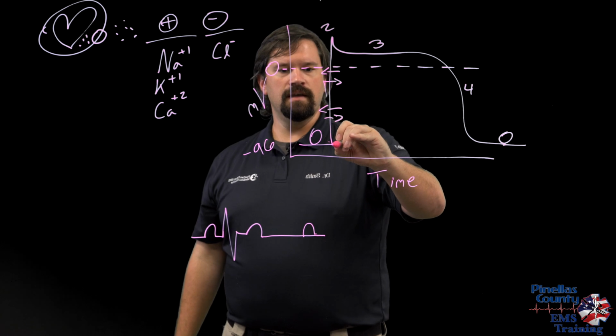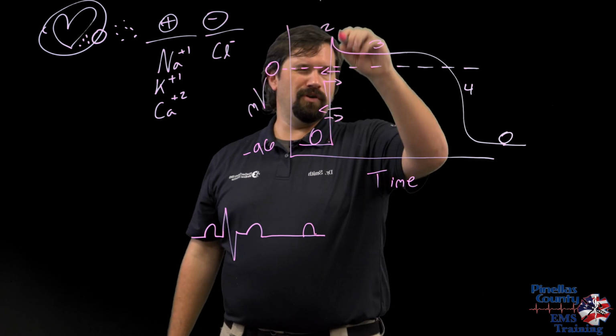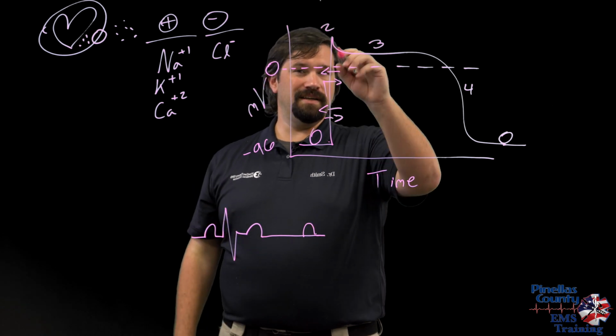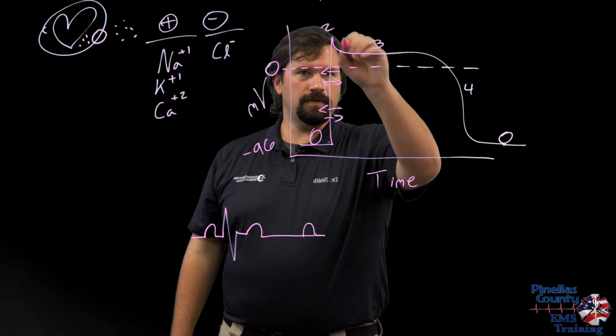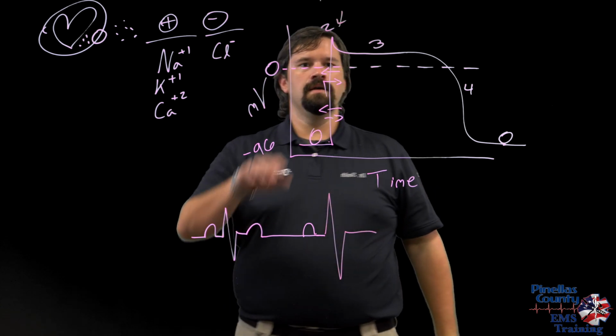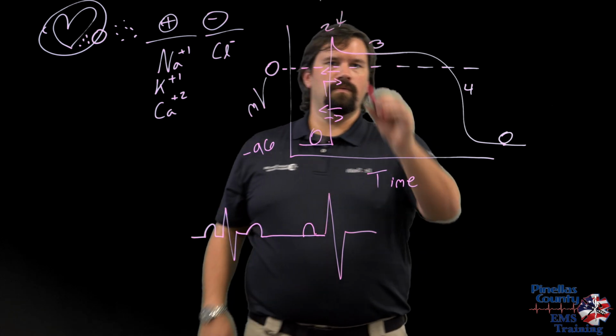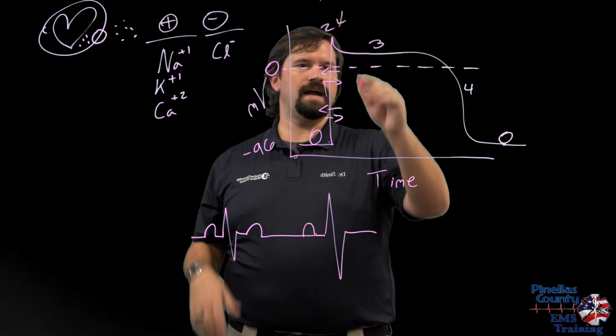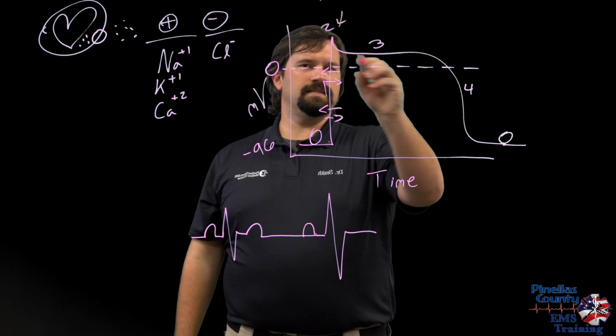So this has a rapid voltage rise. It's not perfectly straight because nothing happens instantaneously, but it's nearly vertical. And this right here corresponds to your QRS. Now, so the QRS is gone, the muscle has fired and contracted. Well, why is it staying positive?